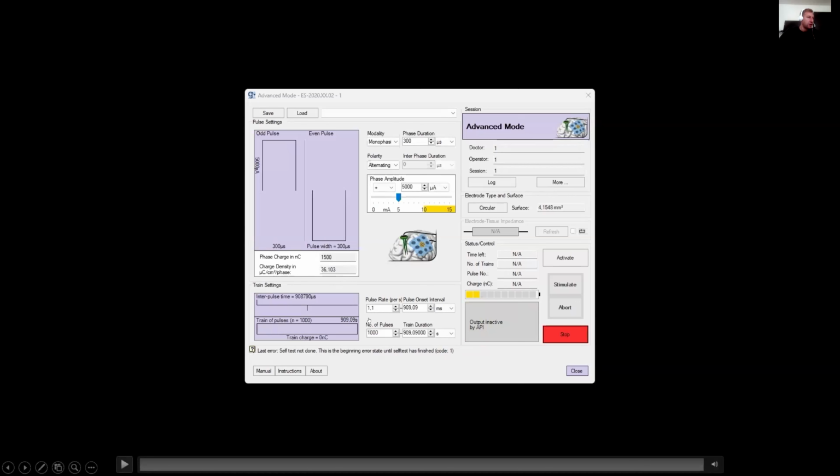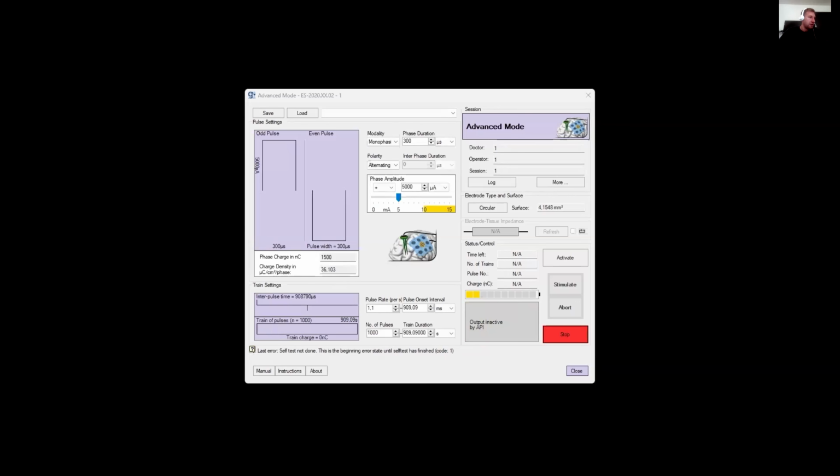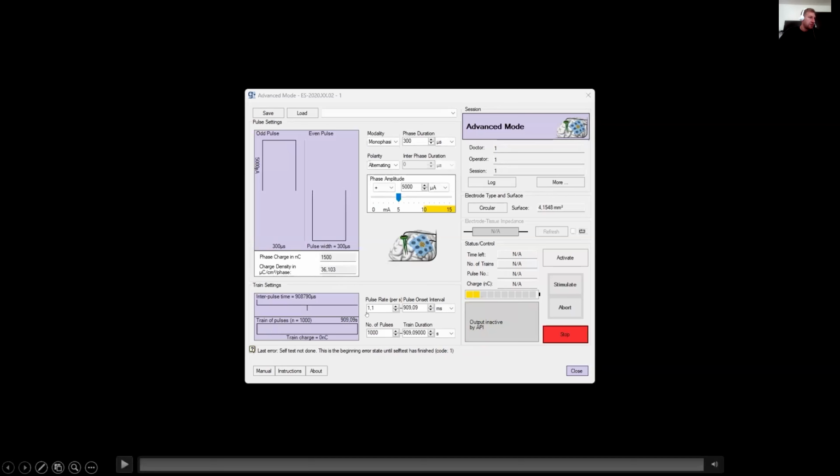And then we are repeating the single pulse stimulation at the pace of roughly 1.1 Hertz or 1 Hertz or 0.9 Hertz. It's good to not use exactly 1 Hertz, because with 1 Hertz you're in phase with the mains frequency, the 50 or 60 Hertz, and by that you're kind of averaging the current phase of the interference in your evoked potential. If you have 1.1 Hertz or 0.9, then you're canceling out the interference by a constant phase shift.